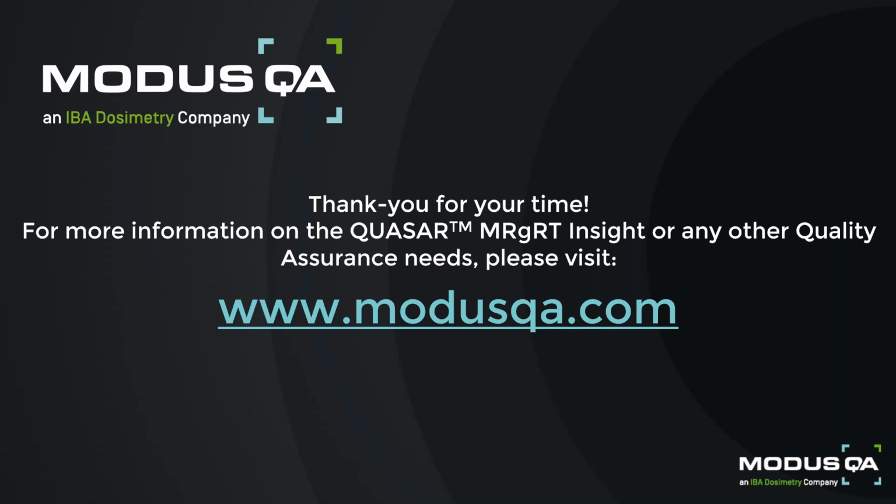Thank you very much. William's question, can Insight be used for geometric distortion? Oh, yeah, definitely. Like I said during the presentation, inside both the upright as well as the coronal base plate, there is an MR contrast filled grid for 2D geometric distortion measurements. And since it's both in the upright and the base plate, you can do that in axial, sagittal, and coronal scans. So you can assess your distortion in all three of those orthogonal planes, respectively.